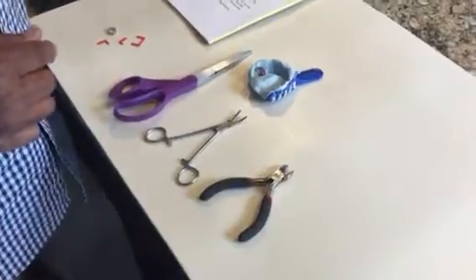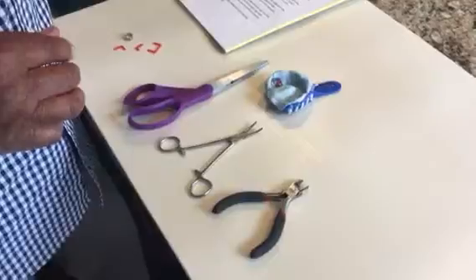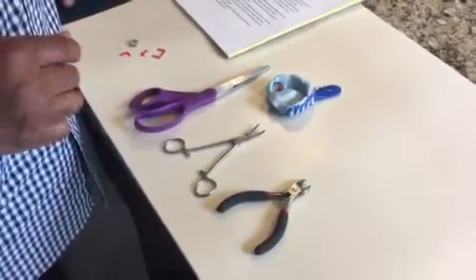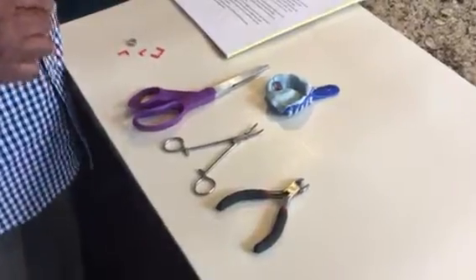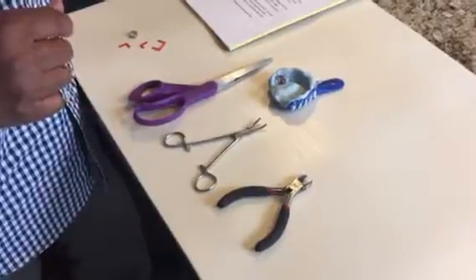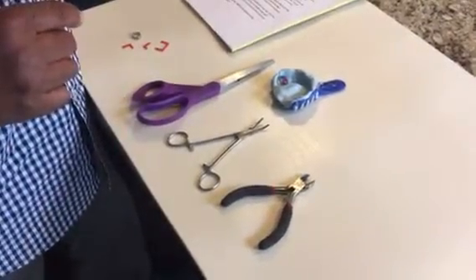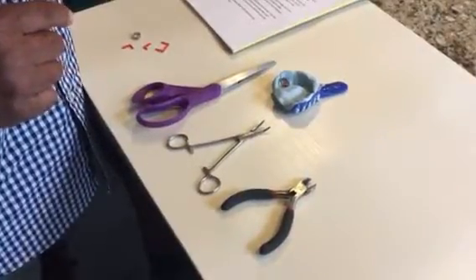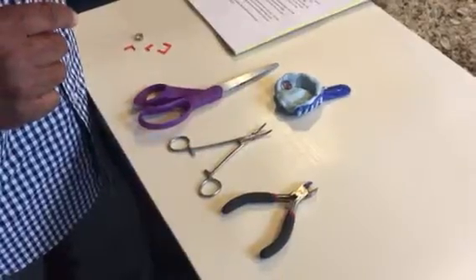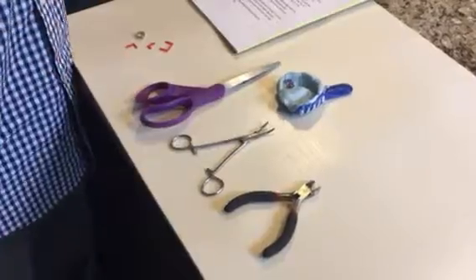I'm here to instruct you on how to seat the Dental Band Alginate Lock, also known as Dballock. The purpose of this device is to prevent the movement of stainless steel bands inside the alginate impressions when pouring plaster or stone into the negative cavity mode of alginate impressions. This device wasn't intended to be utilized in polyvinyl impressions.